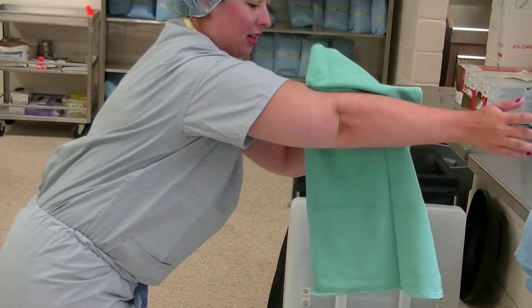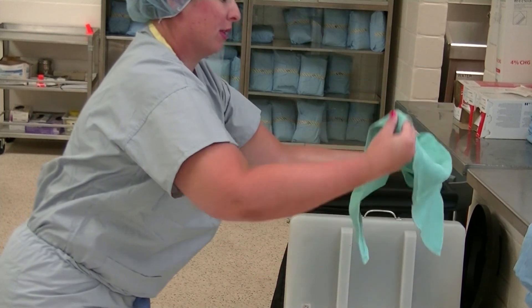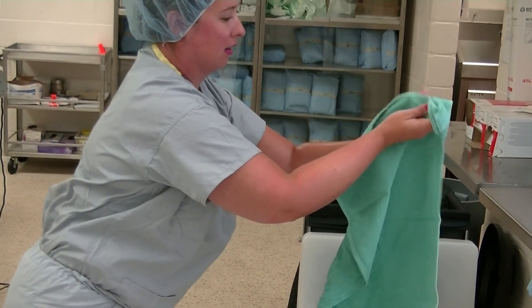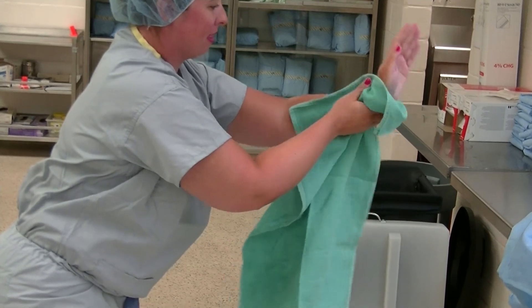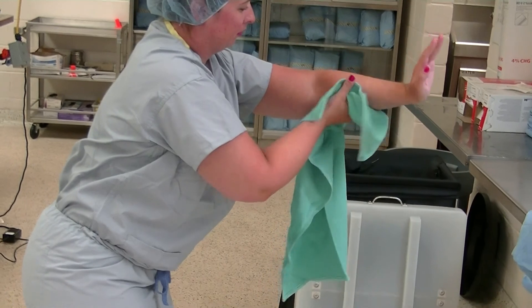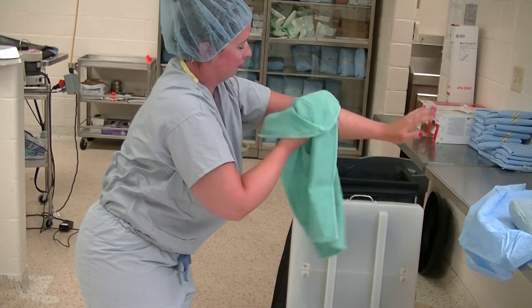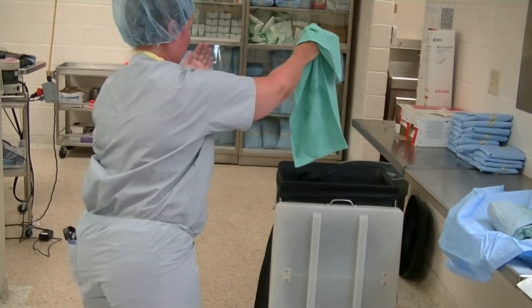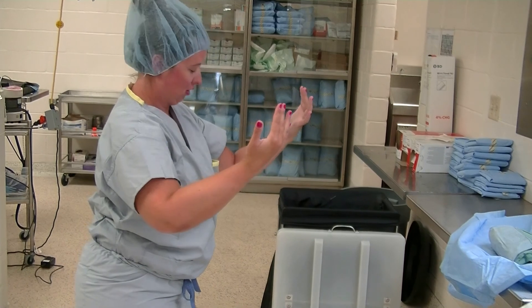Make sure your other clean hand is not touching the towel. Take your dry hand, reach for the bottom corner, and turn your towel around so you have a fresh dry section. Do the same thing on your opposite hand. When done, the towel goes into the laundry and your hands remain above your elbows at all times.